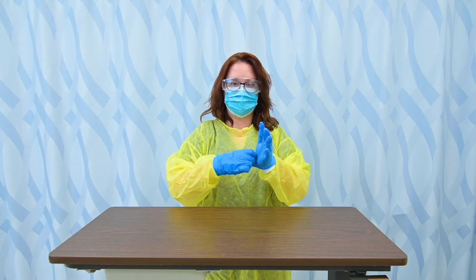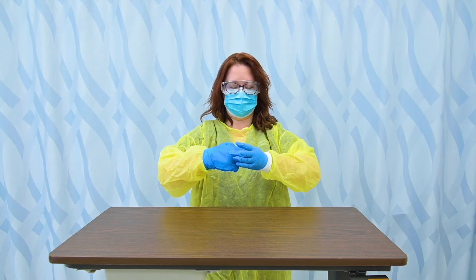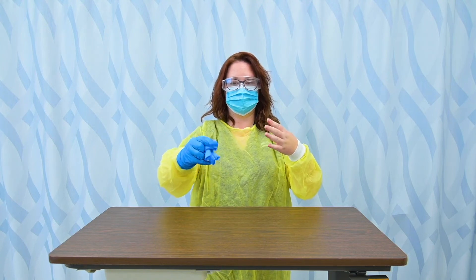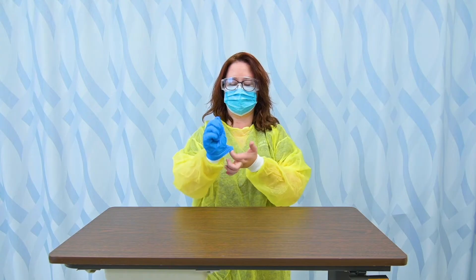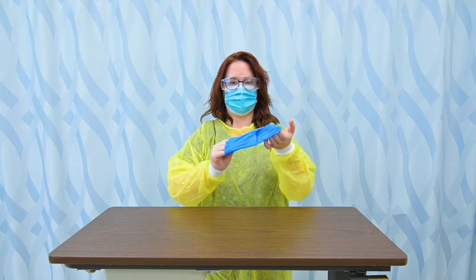I'm going to pull it by the lower cuff, not inside, and I'm going to slip it off. I'm going to roll it up, and then with this hand I'm going to slip it up under that and roll that off. And I'm going to dispose of these — I would throw those away.